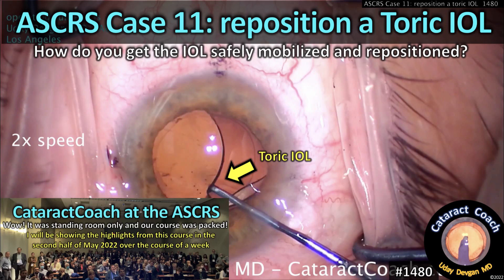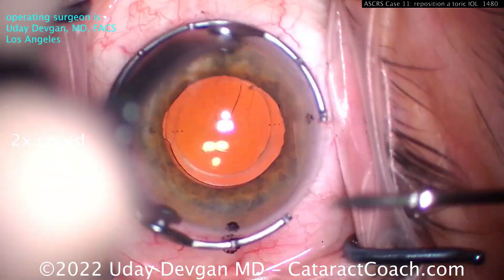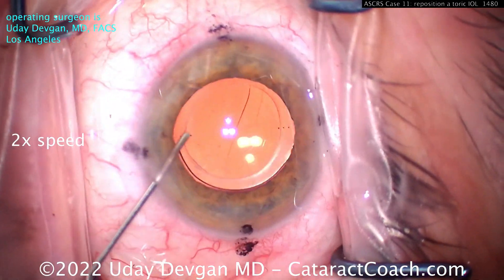CataractCoach.com, ASCRS case number 11: reposition a toric IOL. Here's a patient who had a toric lens placed about 6 months ago, and its axis is off by about 90 degrees.